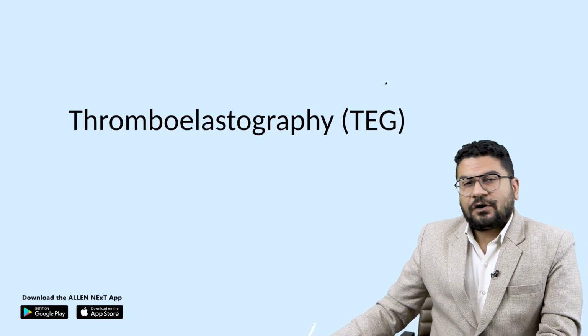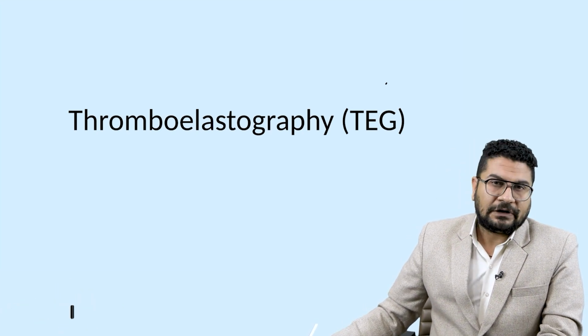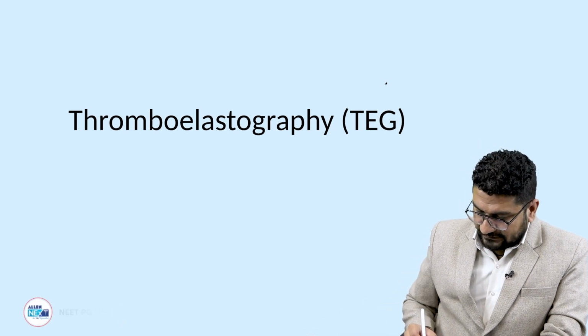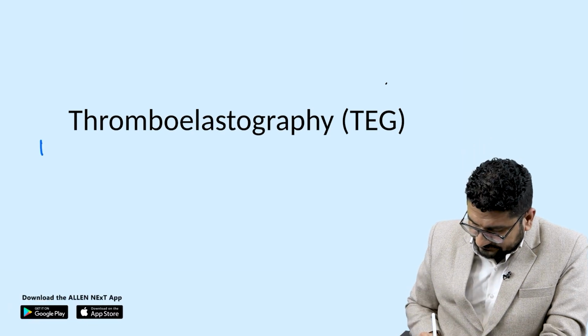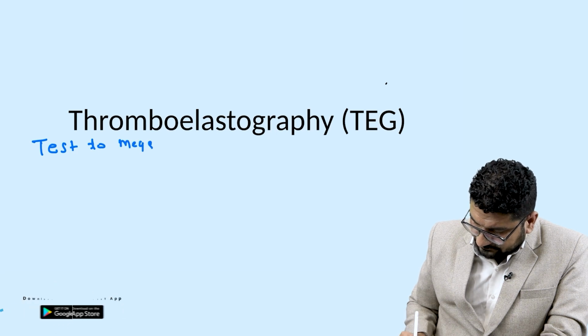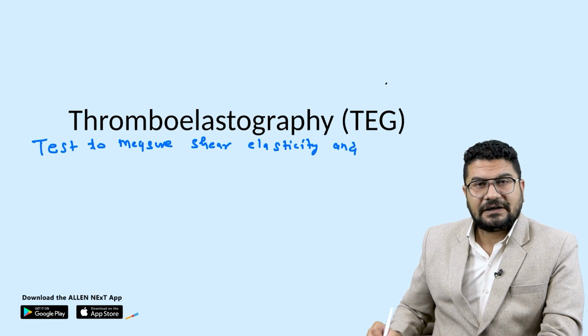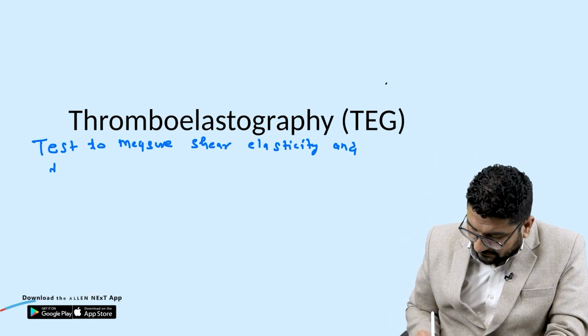Okay, guys, in this video we'll talk about a complicated topic which is frequently tested in the INI-CET exam, that is thromboelastography. Just try to understand this. What is thromboelastography? It is a test to measure shear elasticity. And what else can we check? We can check the dynamics of how a clot is being formed, the dynamics of the clot.